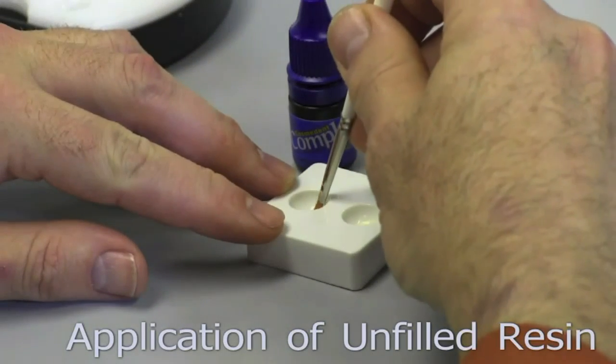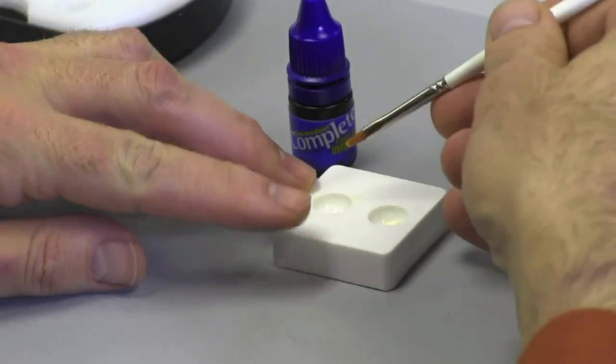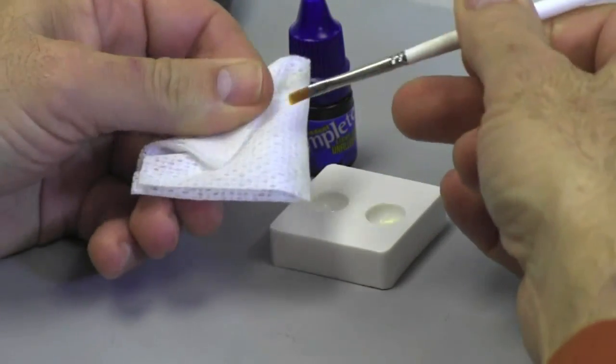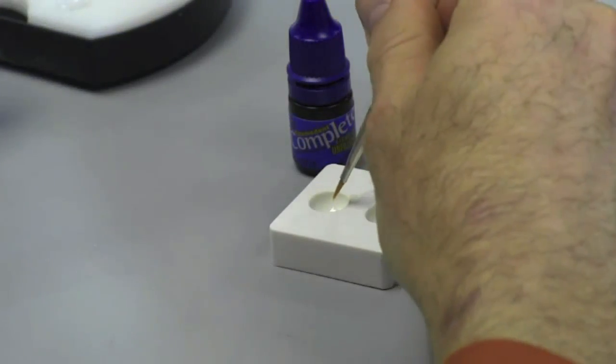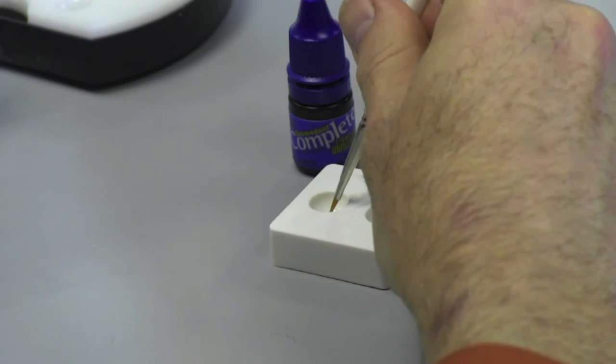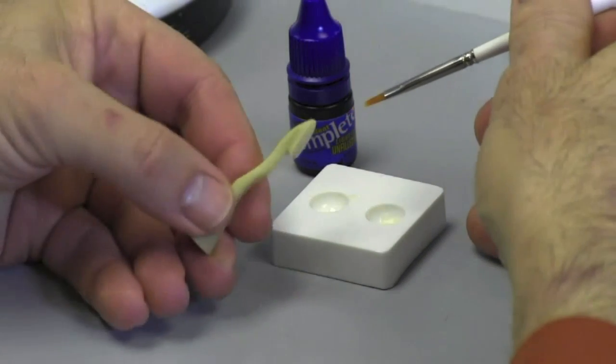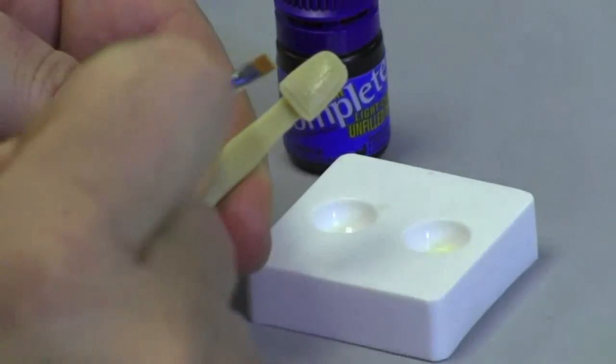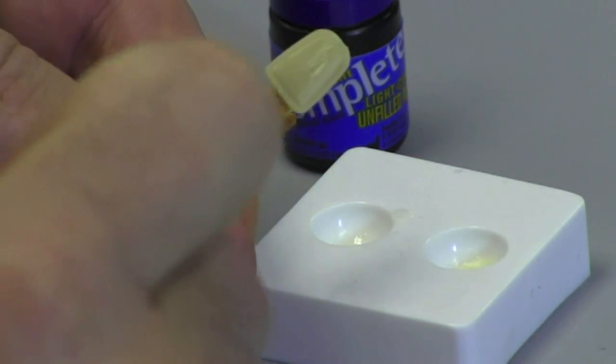I want to start today by talking about the proper way to use a brush. You want to prime a brush with whatever product you're using by saturating the bristles completely, wiping off the excess with a clean dry gauze, and then re-dipping it back into the product for just the right amount of material. This is going to allow you to have a much more accurate placement. You want that to be placed in a thin layer.